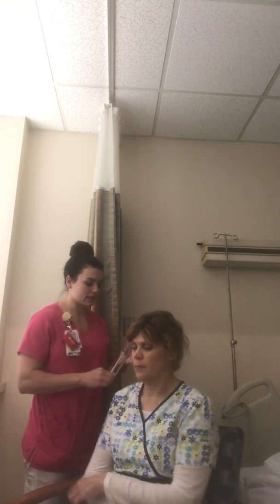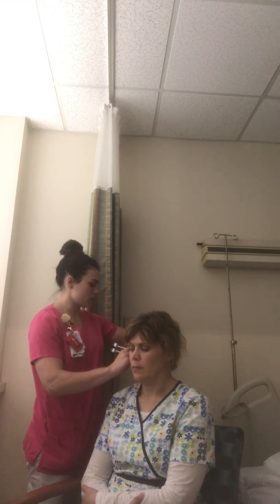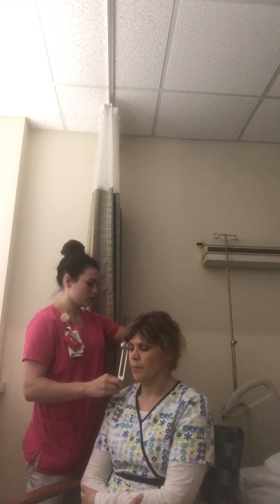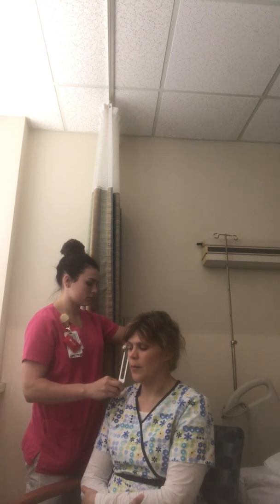Now we are going to do a Rinne test. I'm going to hit it again and put it back here on your mastoid bone. When you stop hearing it there, I'm going to move it to the front, and you tell me when you stop hearing it there. We're going to test both sides. I'm watching on my watch. Okay, great. Moving to the other side.